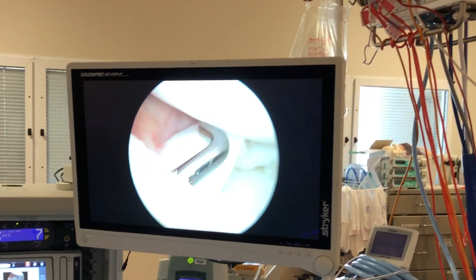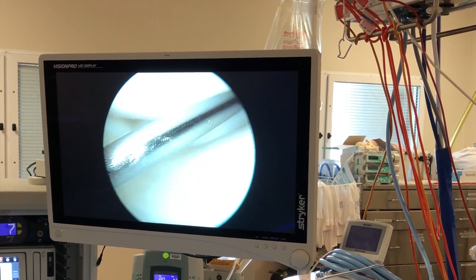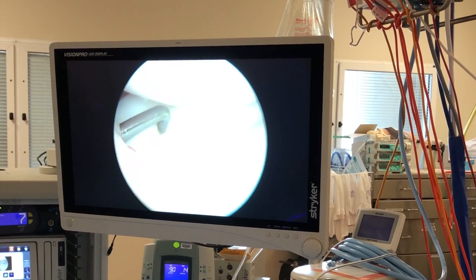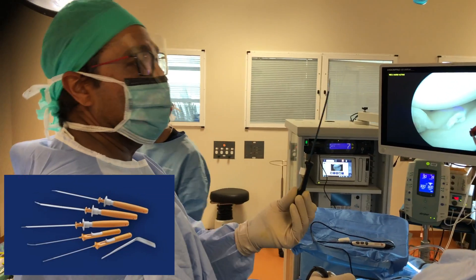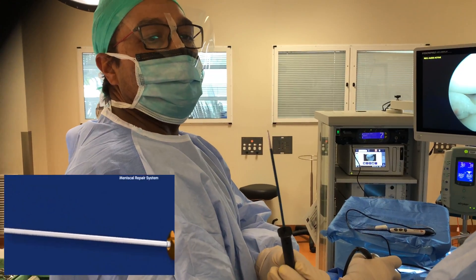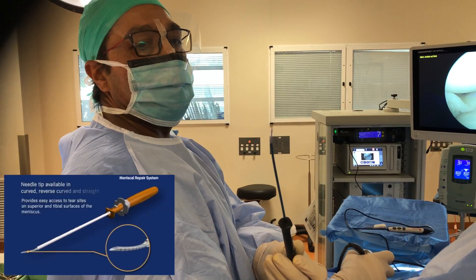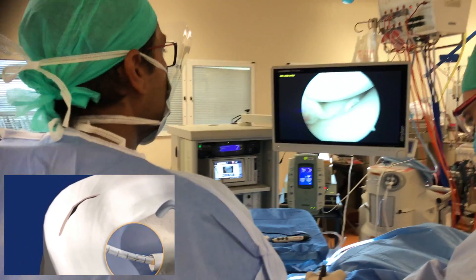The meniscus will have to be held in place, and that'll be done with a fast fix anchor suture. I'm going to put some sutures in. Here's the fast fix anchor suture — there's a needle that's going to go through the meniscus and there are some little anchors that we're going to use to hold the meniscus together.